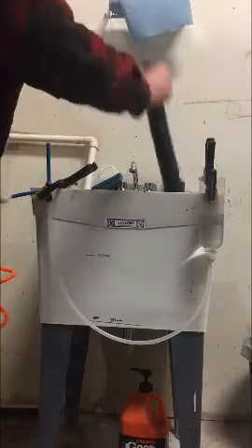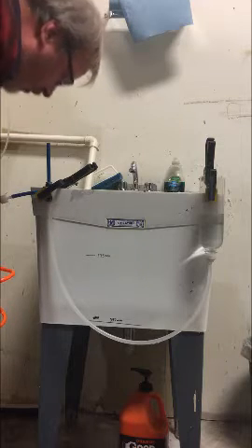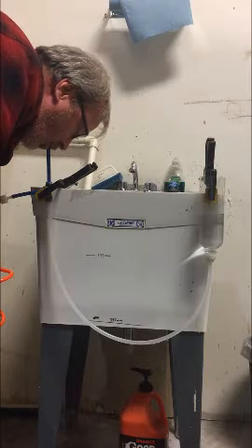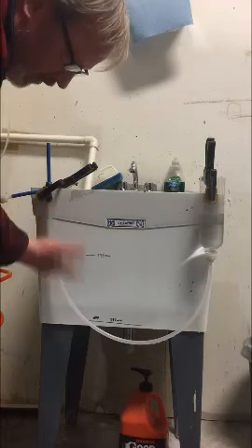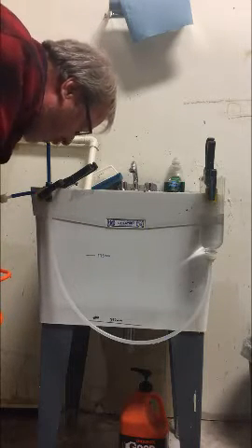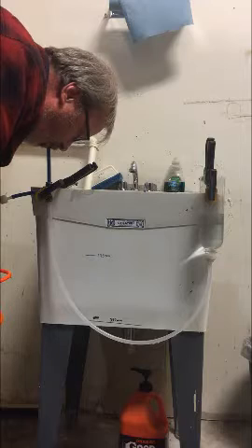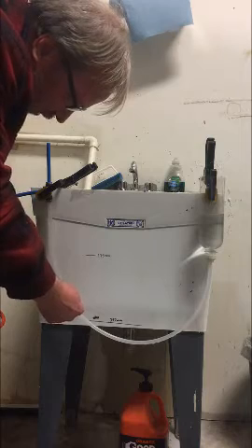The first thing I'll do is I will allow my throat to be open so the air can flow into my throat with very little back pressure. So, I don't know if you can see it on the camera, but the water level in here didn't move at all. I'll now close my lips and apply some amount of back pressure. And you can see the water column was coming down to about here.